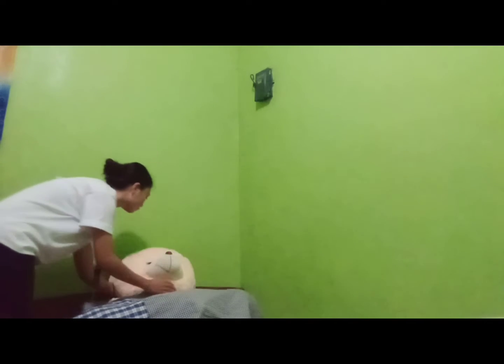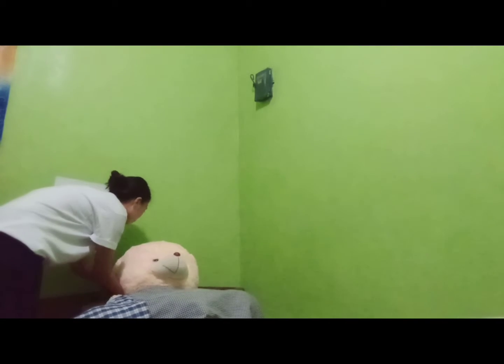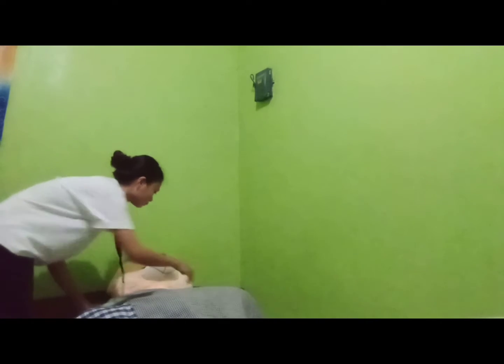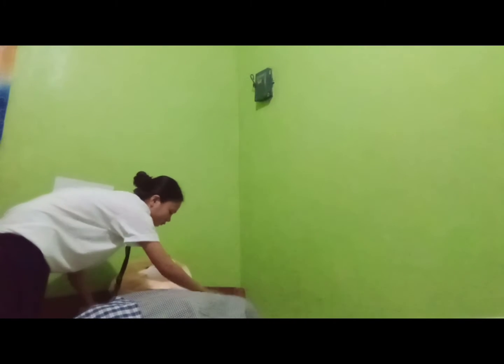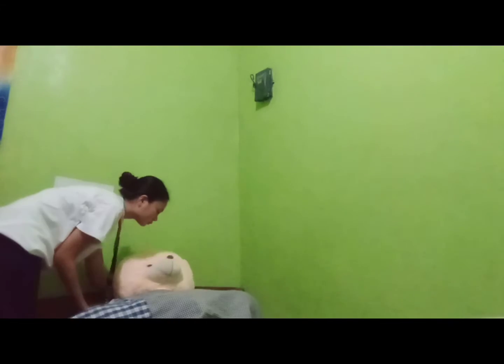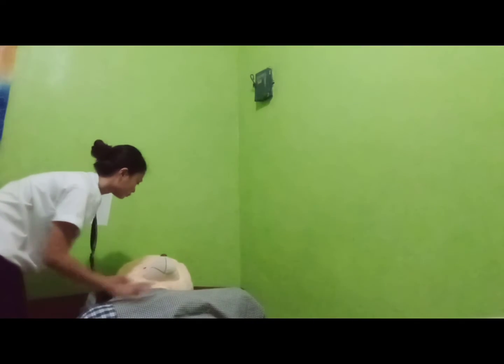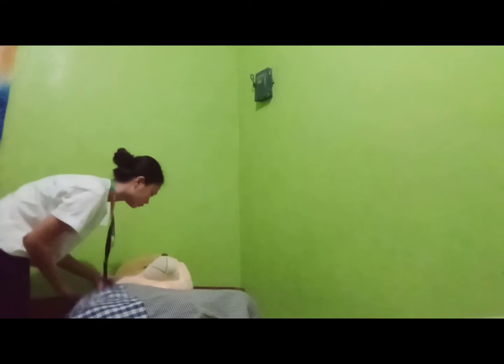Position the client. Position the conscious client with an intact gag reflex in semi-Fowler's position. The semi-Fowler's position helps prevent aspiration of secretions. Position the unconscious client in a side-lying position facing you. A side-lying position facilitates drainage of secretions by gravity and prevents aspiration.